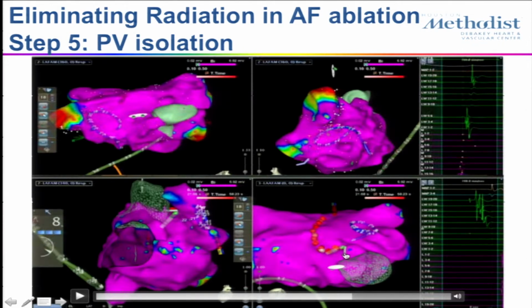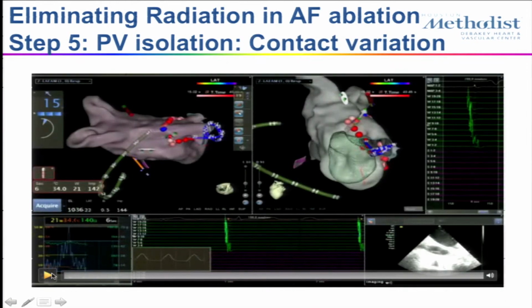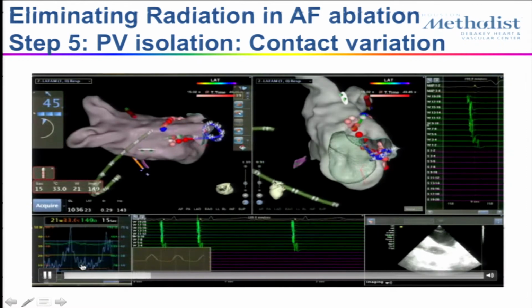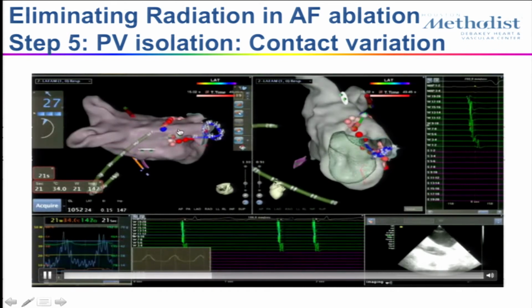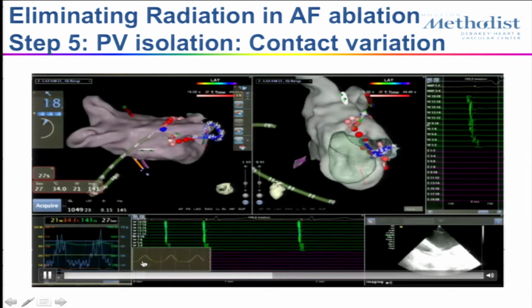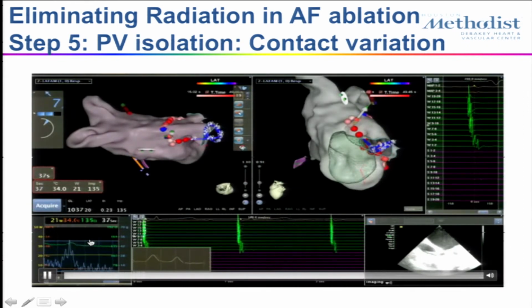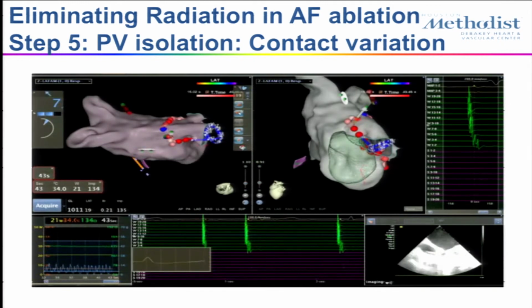Again, this is the contact sensor force. It tells me the direction of contact. One thing that we've learned is that contact is extremely variable. So here I have nice contact pointing up in the roof of the left atrium next to the left superior pulmonary vein, and this is the real-time contact magnitude. So contact is a vectorial parameter, so you get its direction, but also its magnitude, and you see how it goes up and down, up and down. What's going on? This is a respirometer. So I know when I'm breathing, inspiration is when I'm making more contact, because when the patient breathes, the left atrium comes down, I could perforate if I'm not paying attention to this. So this has increased safety dramatically.